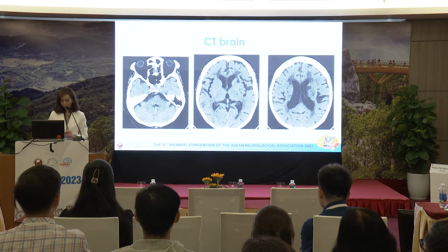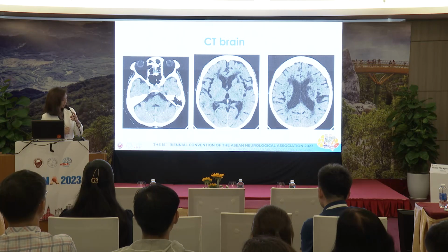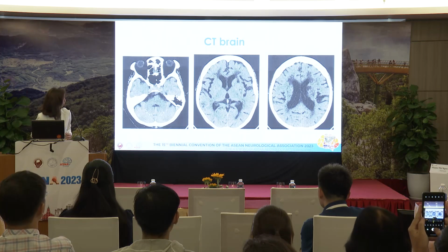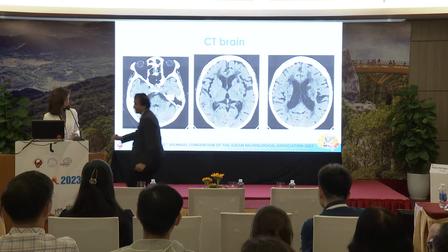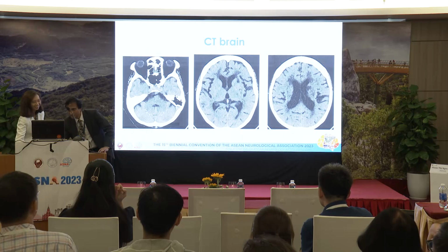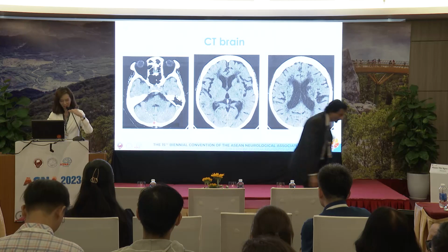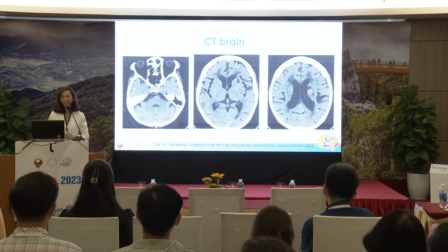So we did a CT scan of the brain, which shows some old lesions on the left side, maybe some old infarct, but she didn't have any symptom of that. A little bit of infarct over here.